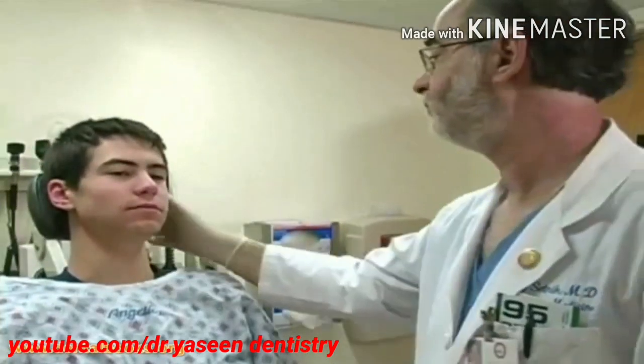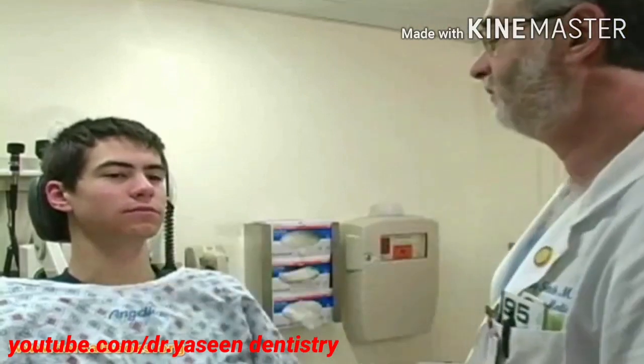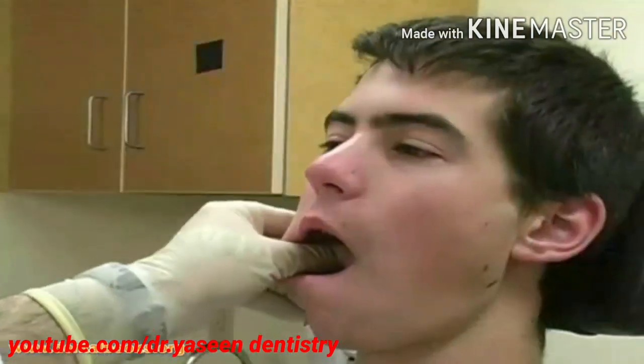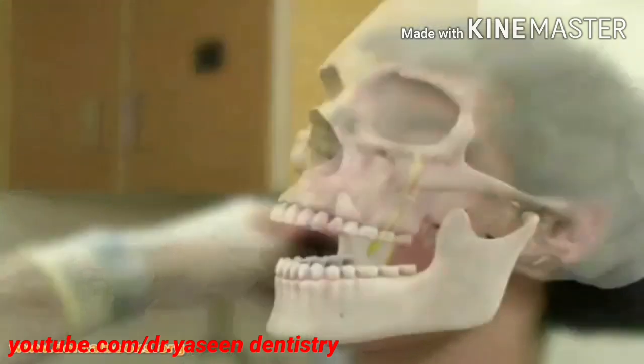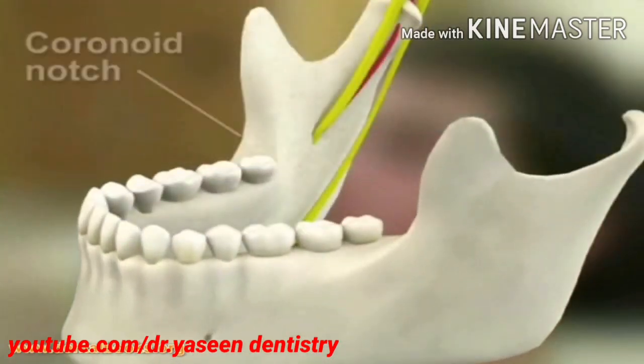Position the patient sitting upright in a dental chair or stretcher so that the occiput is firmly supported. Stand on the side opposite the one being injected. Palpate the retromolar fossa with the index finger or thumb. Identify the greatest depth of the anterior border of the ramus of the mandible, the coronoid notch.